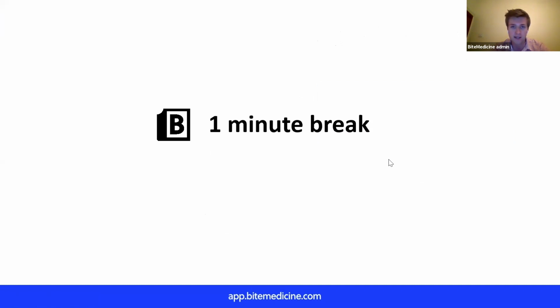So someone asked that the ECG trace for question 1 and 2 was exactly the same. Please explain the difference in response. So the reason the answer was different was because in one case, the patient had adverse features, and in the second one, they didn't. So for adverse features in any tachyarrhythmia, we go for synchronized cardioversion. Okay, so now that was roughly 1 minute.